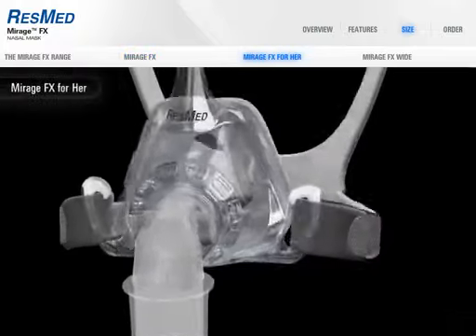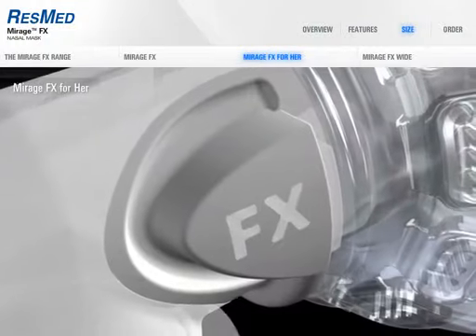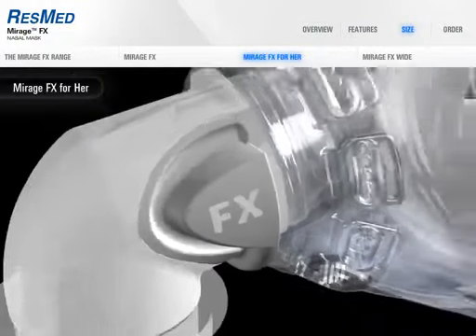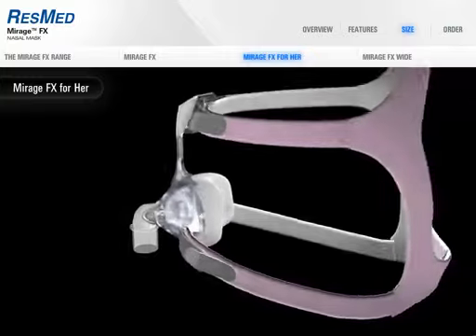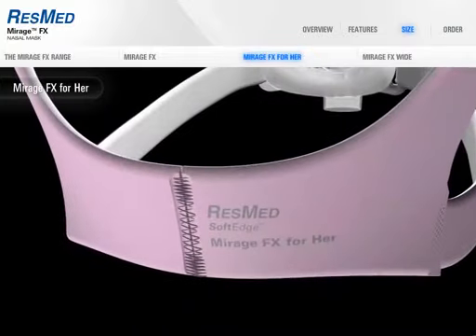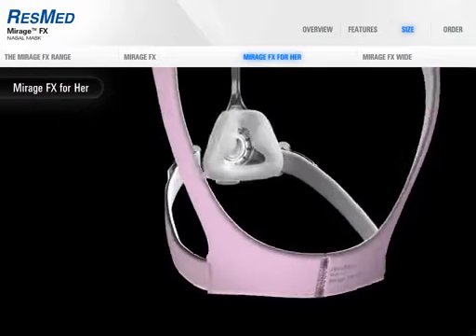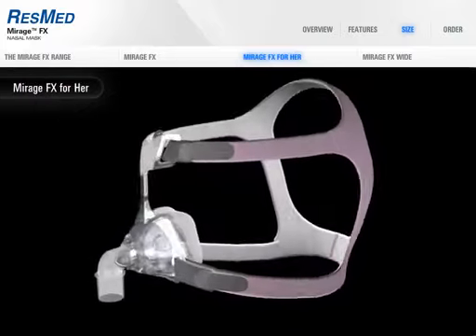Most women will achieve the best fit with Mirage FX for her. The frame is based on Mirage FX standard sizing, but the headgear is smaller with a snug crown strap and hair management options. Whether the user has long or short hair, tied up or untied, the custom-made headgear back strap easily accommodates her personal style, and it's finished in a more feminine color scheme, just for her.